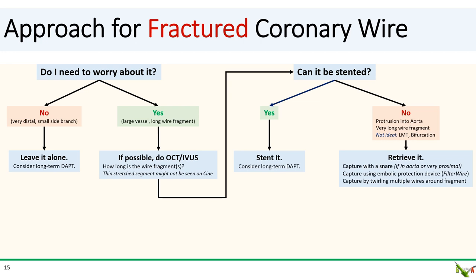Third, you can try wire twirling. The idea is to pass multiple wires — usually three or more — and twirl them around your wire fragment. Once the wire fragment is nicely intertwined with your wires, you then pull the whole thing back as a unit. Sometimes using a guideliner to slide over the intertwined wires before pulling is useful. If you are able to successfully capture your wire fragment, I then suggest doing a follow-up OCT or IVUS to make sure everything is out and that there was no dissection. You can place a stent if needed at this point.